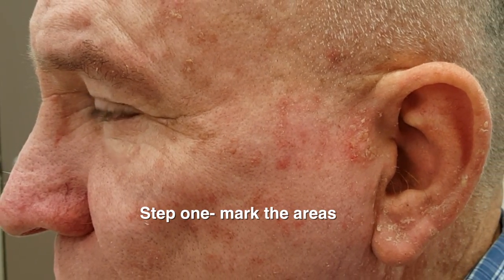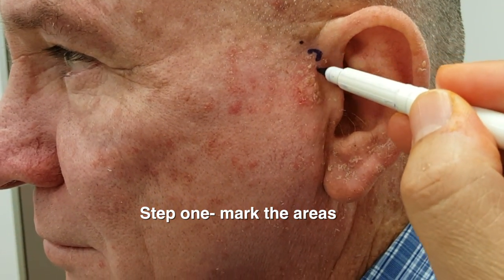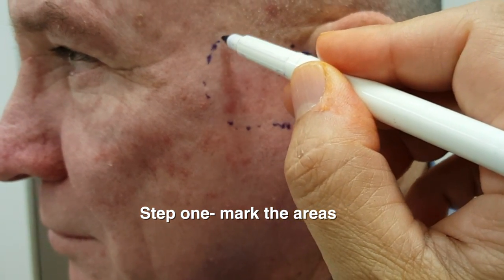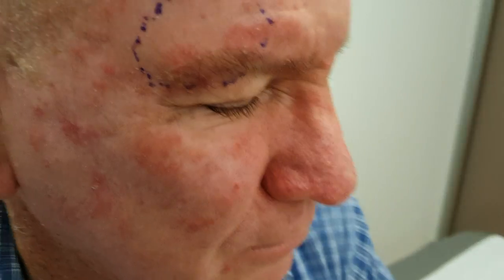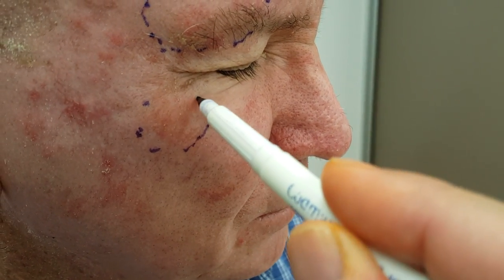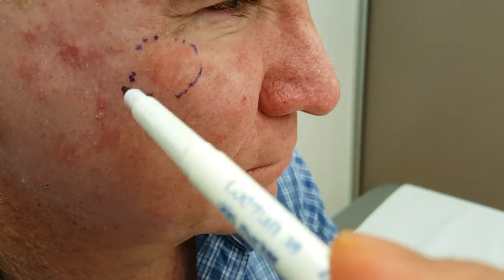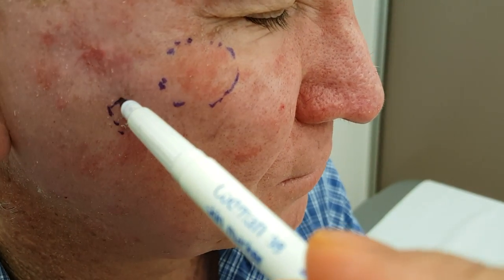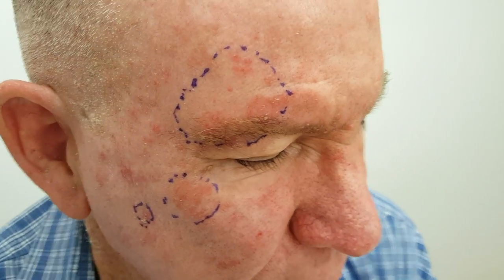This patient has an immense amount of sun damage. We start with the thickest areas, which are the most precancerous areas known as IECs. On the other side he's got confluent areas of solar damage. All these red marks which are scaly are basically precancerous cells called solar keratosis, and he has heaps of them. He is almost a candidate for full face PDT but we're just marking out a few areas to begin with.